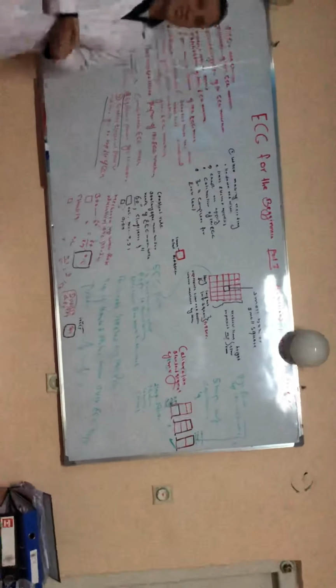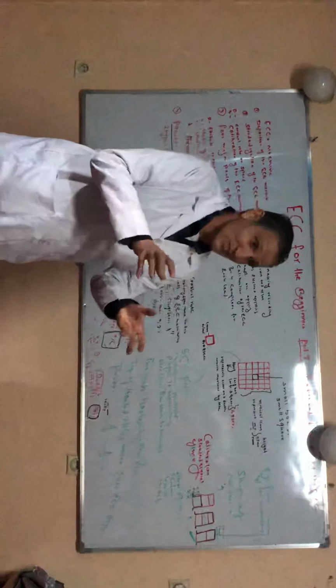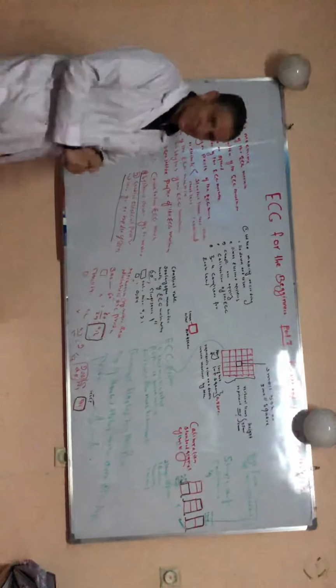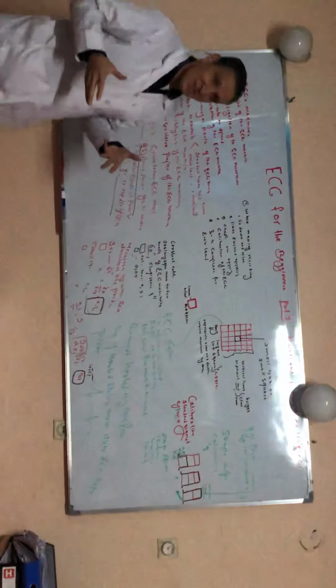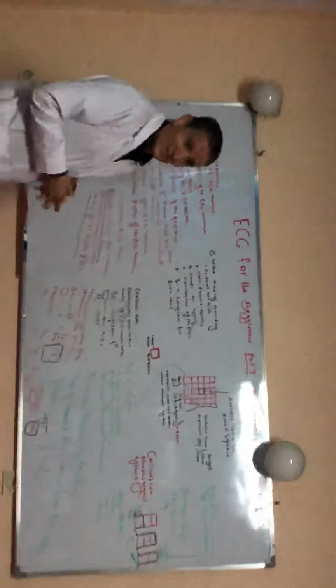Now, when making a recording of the ECG, before we take the ECG, what cautions are necessary for the patient? Number one, we ask the patient to lie down and to be relaxed. What is the reason? Because skeletal muscle tremor may be recorded concomitantly with the cardiac electrical impulse. So you ask the patient to lie down and be relaxed to prevent skeletal muscle tremors.